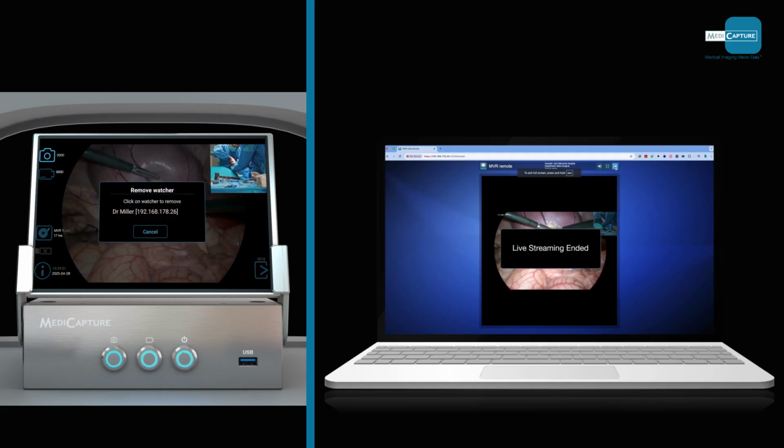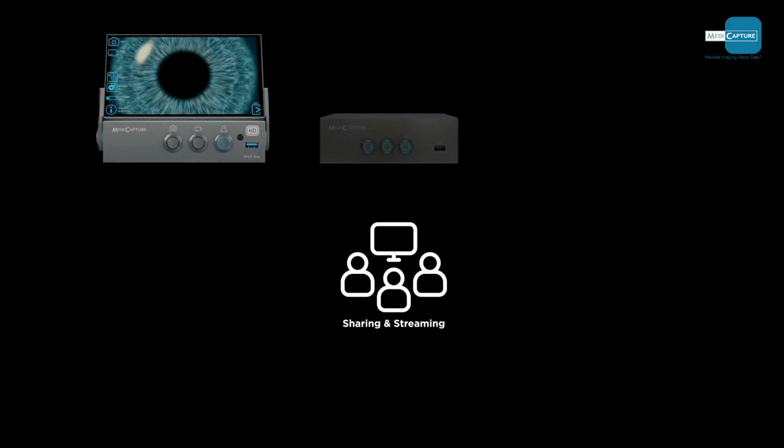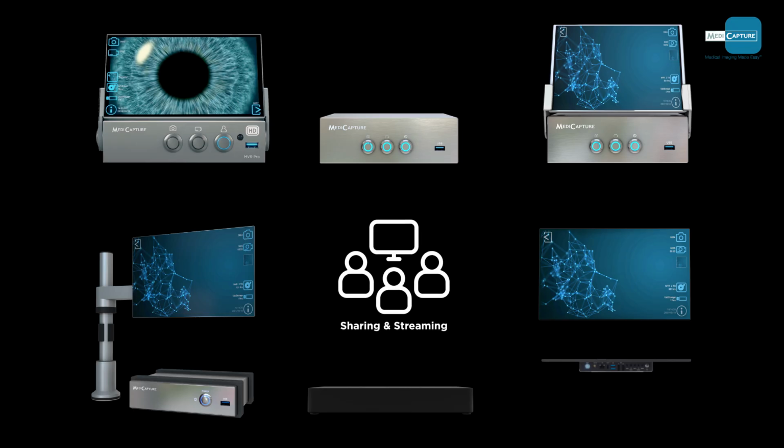Need to end access? Simply remove the viewer from the list and the stream closes on their end. You can experience network-based live streaming with one-directional audio on all MediCapture recorders and archiving systems.